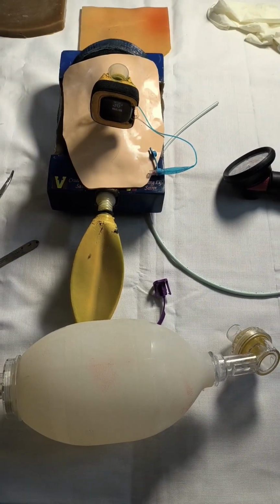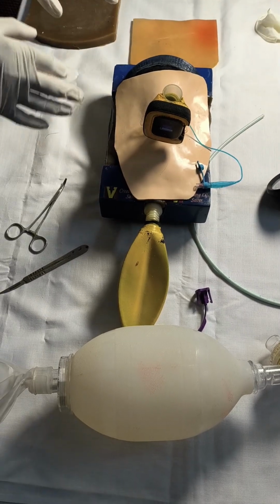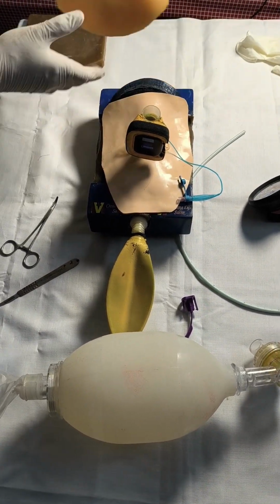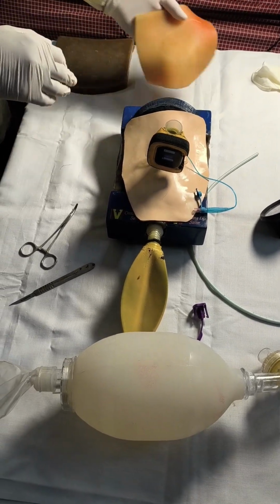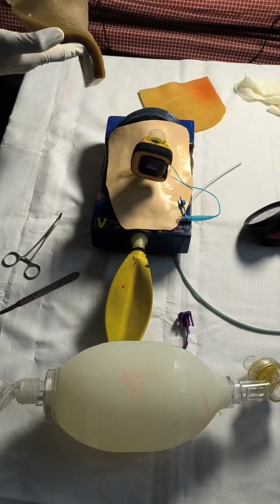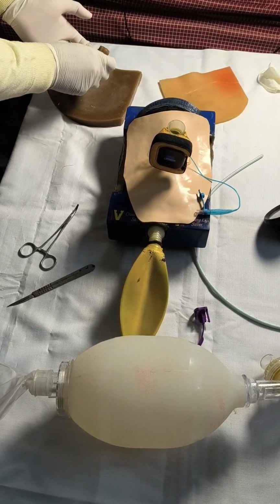So we can do deliberate practices by mental visualization and by doing the actual procedure. Now to give the whole package, we have this silicone skin, which almost gives you a human feeling. And if you want to practice on an obese patient, then this is a thick skin pad, which can be used to simulate a thick neck.